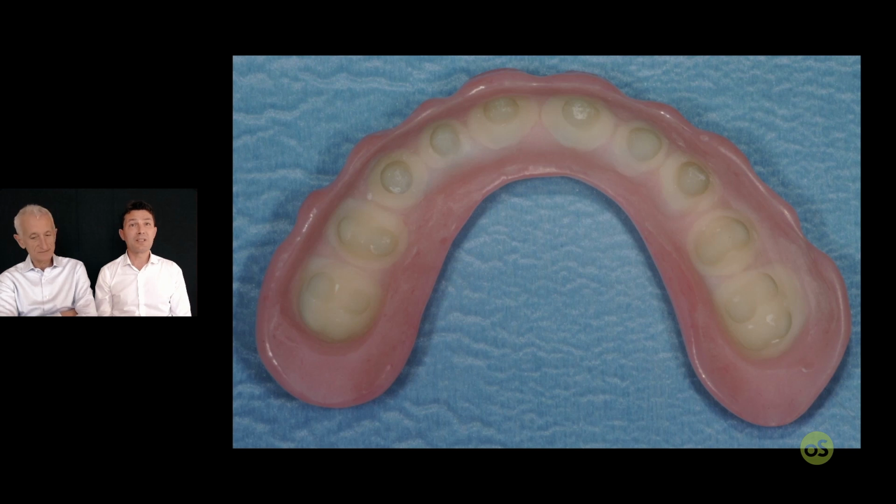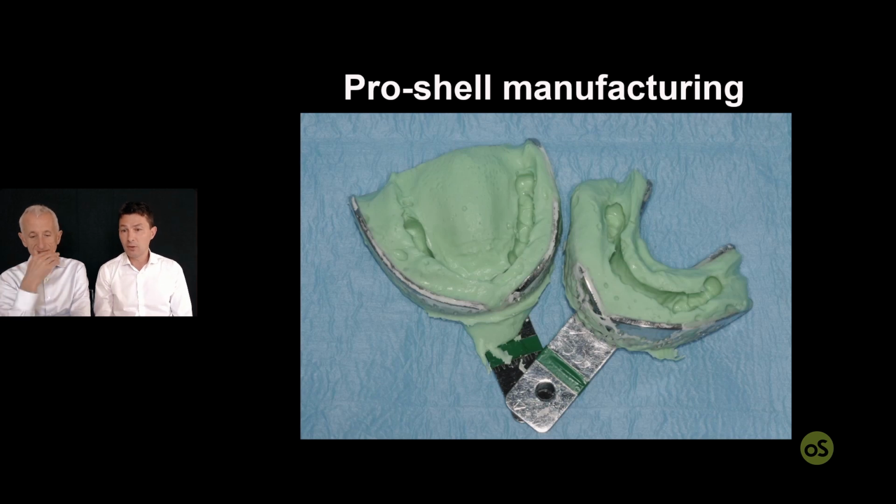Especially in the intraoral step procedure, because the PMMA is not elastic, but is more elastic than the composite, and for sure you give a lot of elasticity to the restoration. The last case is not a full arch, because for me the approach is the same.